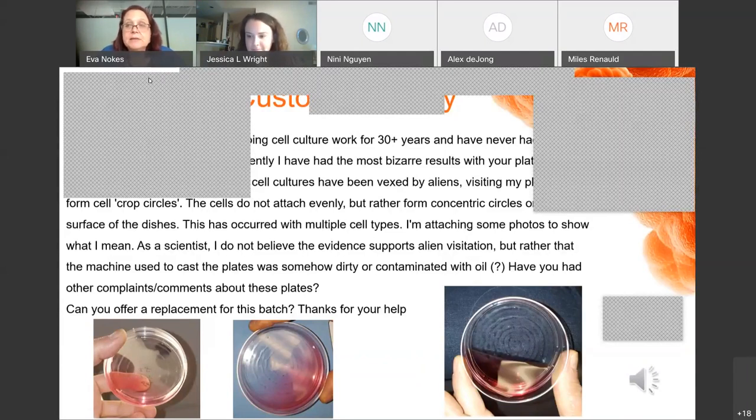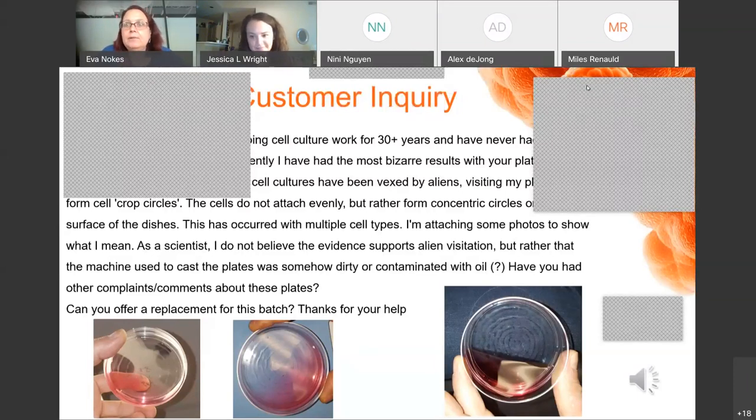Months. I worked with some patient cystic fibrosis cells from Children's Hospital at my drug discovery company, and we kept them for months on end, on a Corning product, I might say. But it really depends on the cell type and on how much you baby them, how much you take care of them. Those primary patient cells, we had to feed them every day. And I mean, that means Christmas. That means every day we went in and fed them.